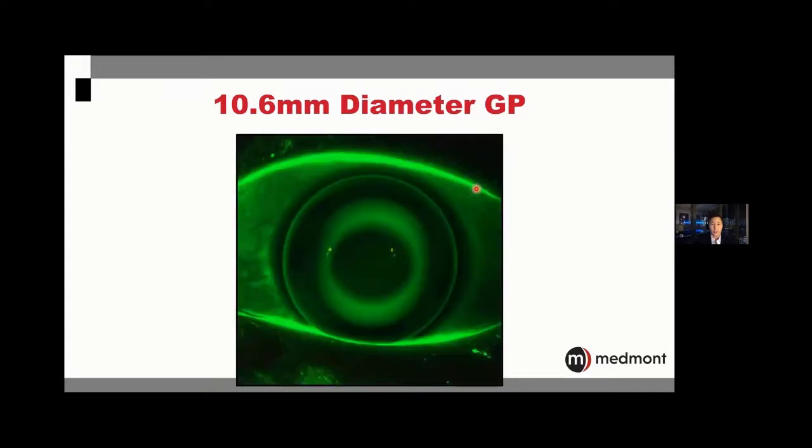In your ortho-K lenses, we probably need this kind of imaging the most, where we're trying to create those finite little changes to create the perfect outcome. Being able to, again, share this with the lab is a valuable tool.